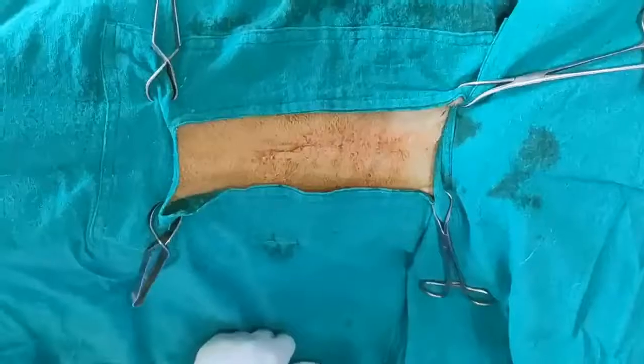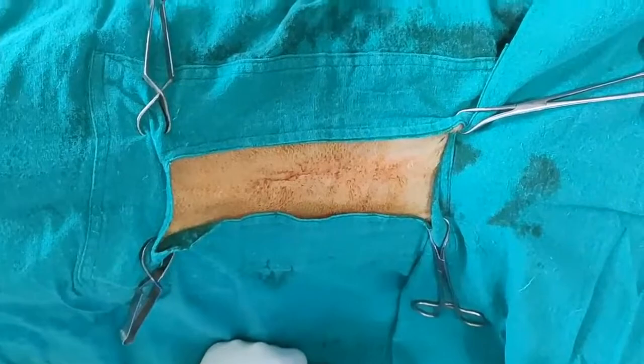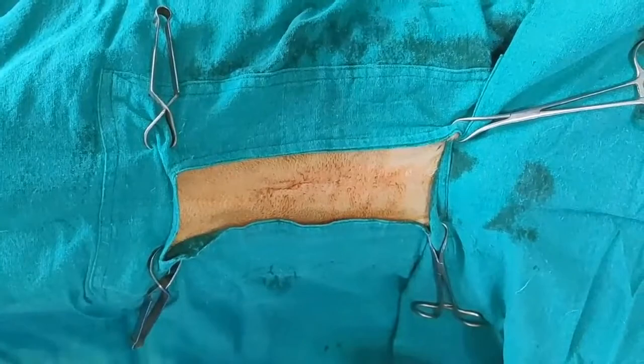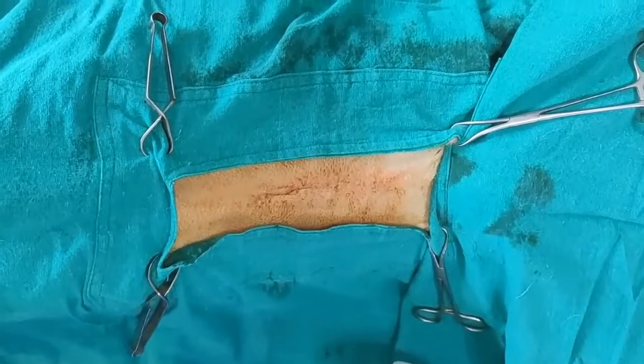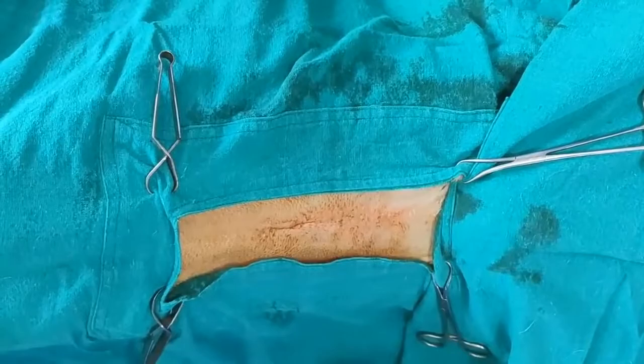I am going to perform a laparotomy for the removal of the obstruction located in the small intestine. The history of this bull mastiff dog is that he had stopped feeding and taking anything in the last 14 days and has a tendency to vomit in the morning. The animal has vomited every morning for the last 10 to 14 days.